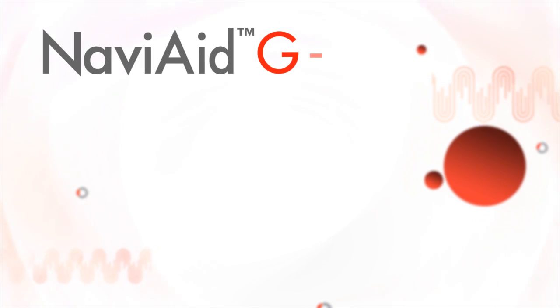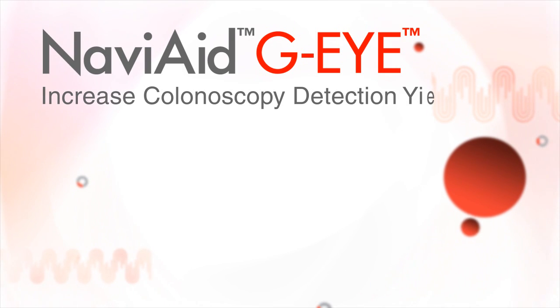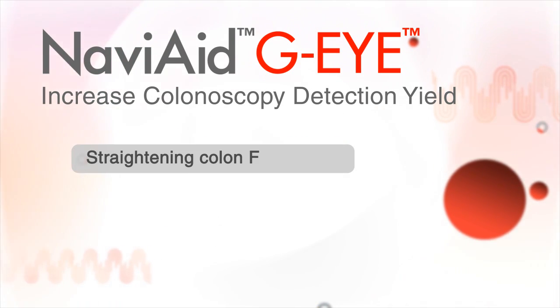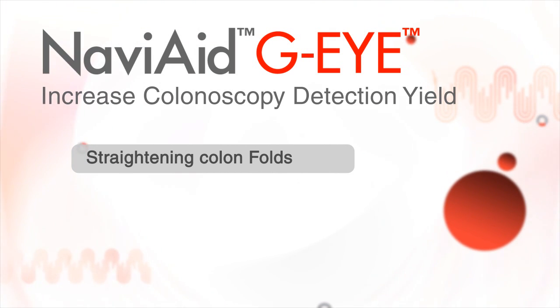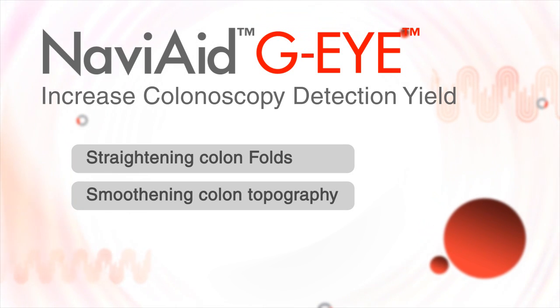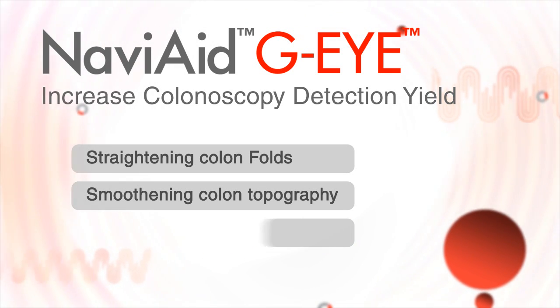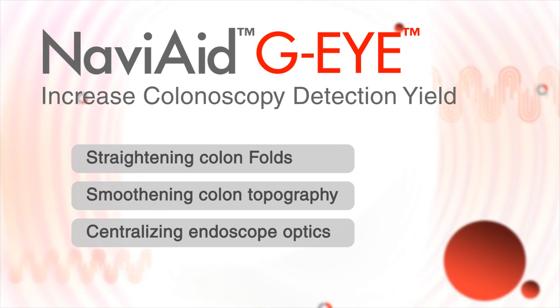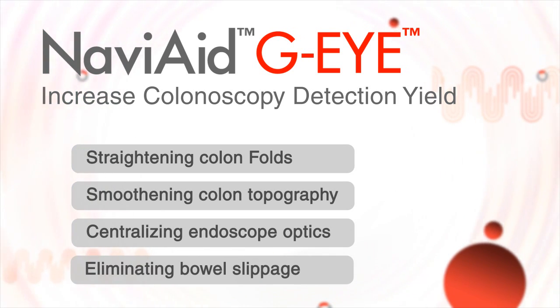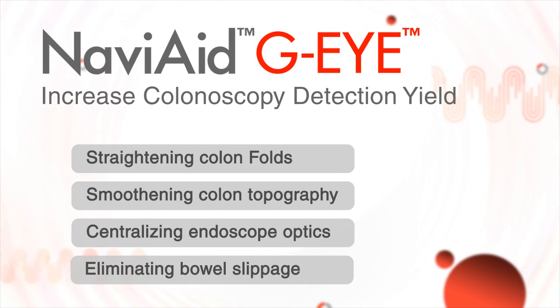The G-EYE endoscope increases polyp detection yield by providing several key features: straightening colon folds and allowing clear visibility of the lumen, smoothening colon topography, making polyps more apparent, improving visibility by centralizing endoscope optics, and eliminating bowel slippage and overlooked colon sections.